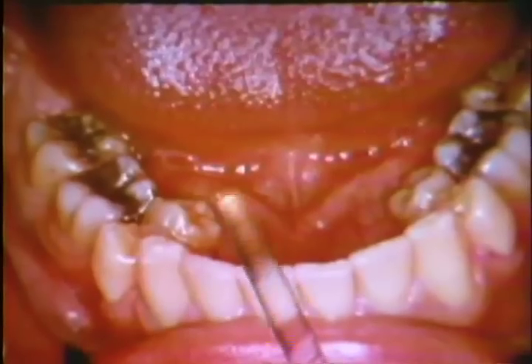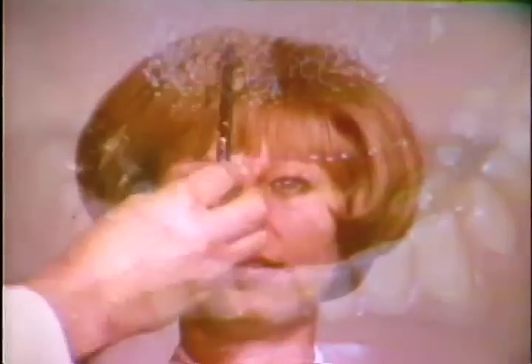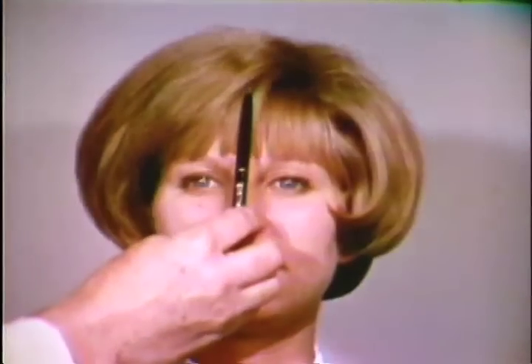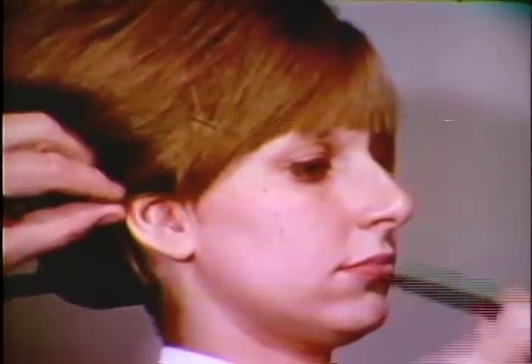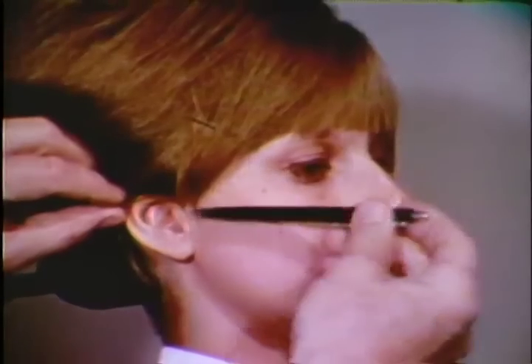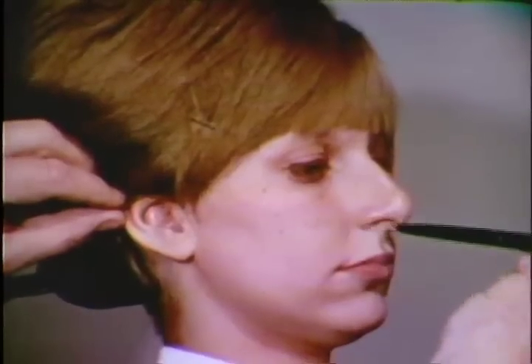We will now proceed with our standard procedure. The patient's head must be positioned so that the midsagittal plane is vertical. In a profile view, the line from the ala of the nose to the tragus of the ear should be horizontal. The occlusal plane of the teeth will then also be horizontal.